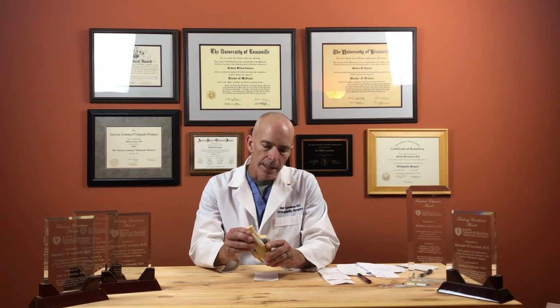The thought is that with the robot, the cuts will be a little bit more accurate, and so when you're done with your total knee, the alignment of your knee will be exactly what you're aiming for. If you use conventional methods, there's a small subset of people that have their knee in a little bit of varus, which is in, or a little bit of valgus, which is out. The robot does seem to help cut down the amount of outliers, meaning the people that aren't exactly as you mechanically align them. The percentage of outliers with conventional is a little bit higher than using the robot. So the robot does seem to make the mechanical alignment a little bit better.